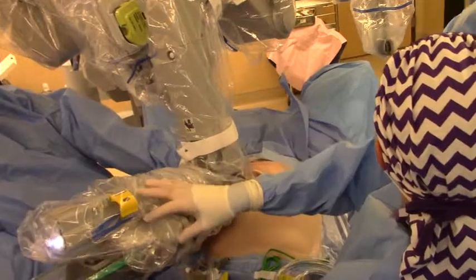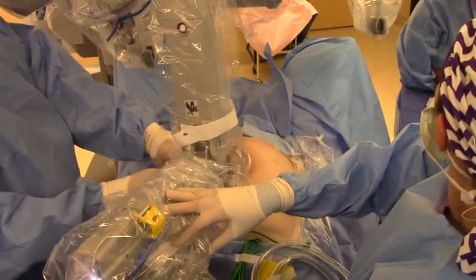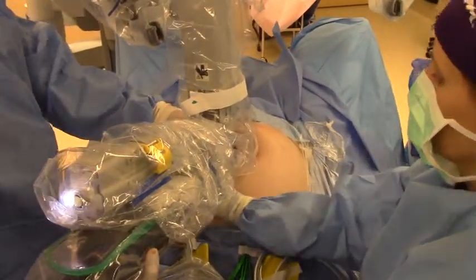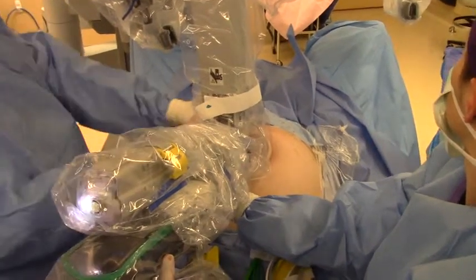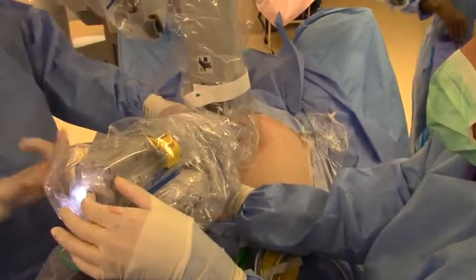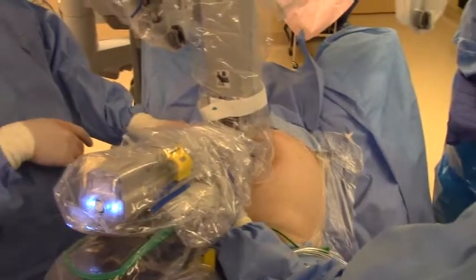Which is totally backwards from what they see. And if you ever take a class with Swainstenev, he'll teach you all that kind of stuff. Because you go in and just turn your trocar up against the wall to go in — you're not going to hit anything. You've already looked to see there's nothing there. So you can basically curve in like that, and she just kind of follows to make sure where the anatomy is with that.